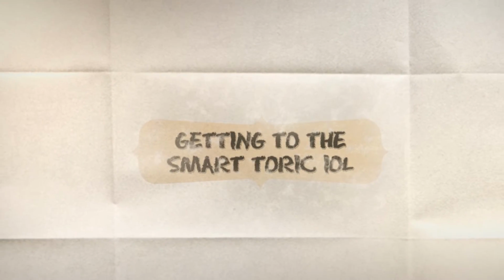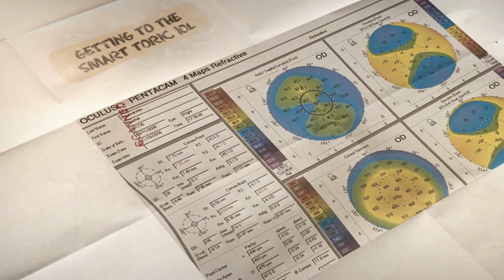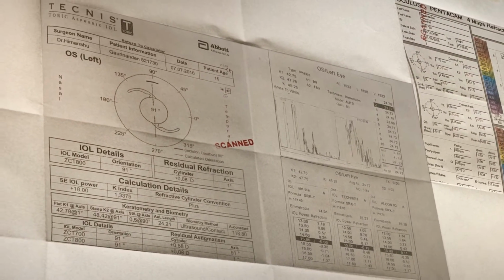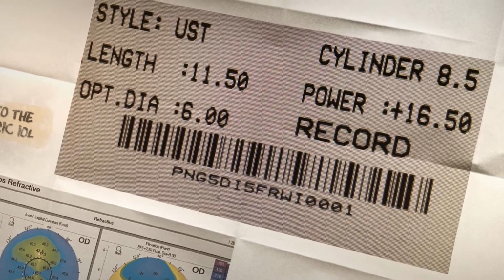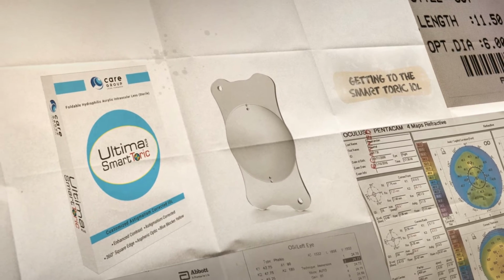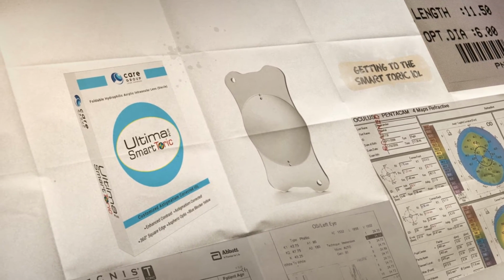Now going into the details of how to obtain the toric IOL, keratometry and topography values are obtained. These values, along with the surgically induced astigmatism, are entered into the toric IOL calculator, which gives the desired dioptric power of the intraocular lens. Now this makes us choose a customized SMART TORIC IOL, as the regular toric IOLs available in the market only correct 6 diopters of astigmatism in the IOL plane, but we needed almost 8.5 diopters in our case.